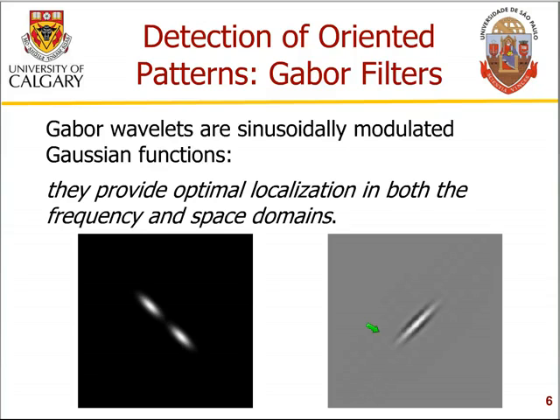So the bell-shaped curve is modulated, so we have a main positive part of the bell, and then negative parts and positive parts that decay. And this is a two-dimensional function. And in this image, it is shown as an intensity image, where the positive main lobe is seen in white here in the middle, and then on either side, you have black parts that indicate the negative side lobes, and then there are positive side lobes. The filter has been oriented at 45 degrees and is anisotropic. That is, the variance of the Gaussian is larger in this direction than in the orthogonal direction.